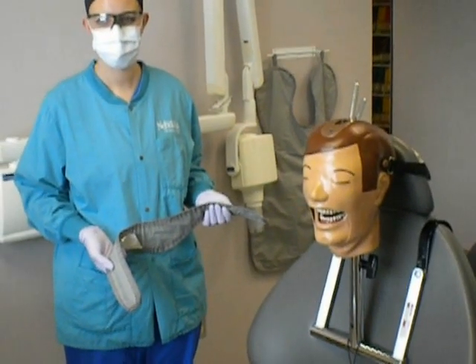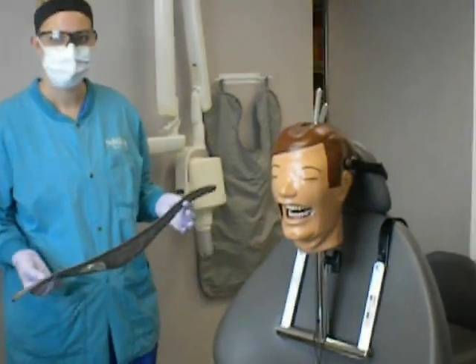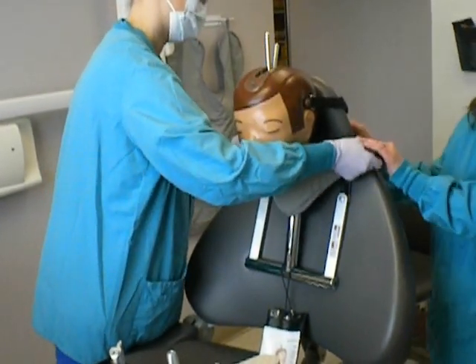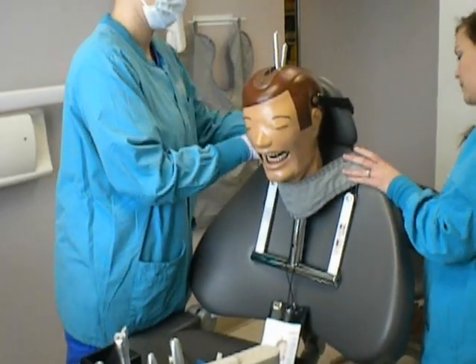Incisor and canine periapical. Before you start anything, remember to place a thyroid collar or protective vest on the patient to protect them from x-rays. Make sure the patient understands that they are not to move while the radiograph is being taken.